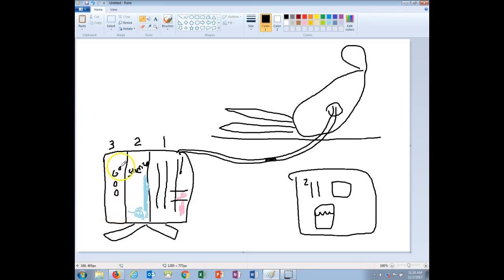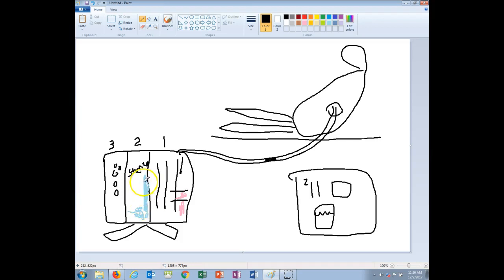Like I said, if it looks like a jacuzzi in here, that's bad, there's an air leak. Bubbles in the suction chamber absolutely okay, especially if you're doing wet suction. Tidling good. Now if tidling stops, that could possibly mean that the lung has re-expanded, or there might be an obstruction within the system. So it could be good or bad, but that's the first thing you should think of if tidling stops.